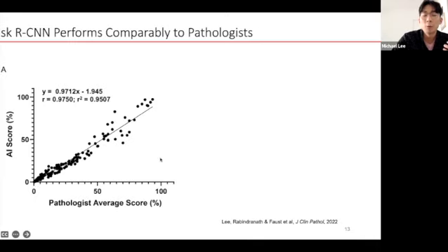And so what we wanted to do next was be able to see how the AI performs, especially with regards to this newly trained instance segmentation based approach with pathologist average score. And so we took this nuclear stain Ki67 and had AI score around 100 images of Ki67 at varying quantification levels, and had 3 different neuropathologists average the score as well. And as you can see, the correlation of the result is very, very strong here between the AI and the pathologists.